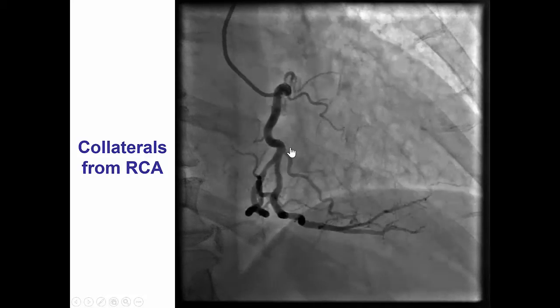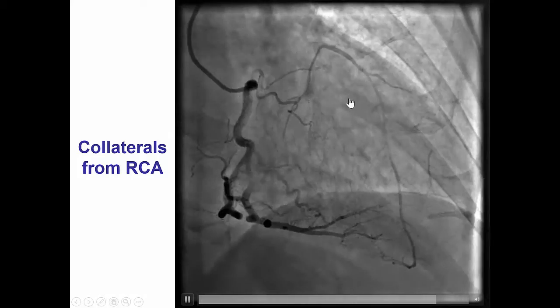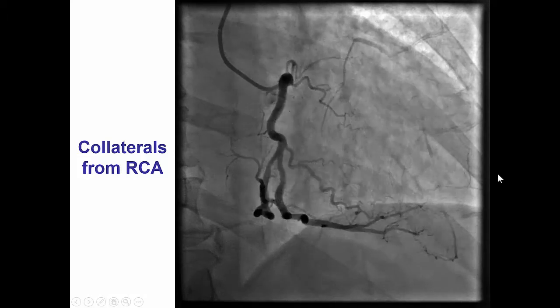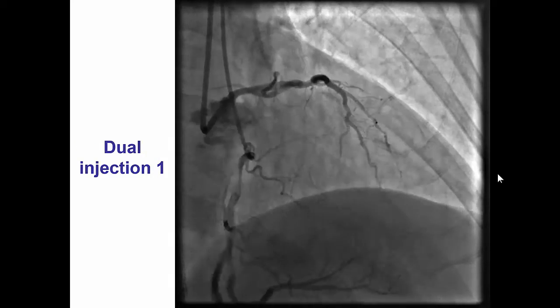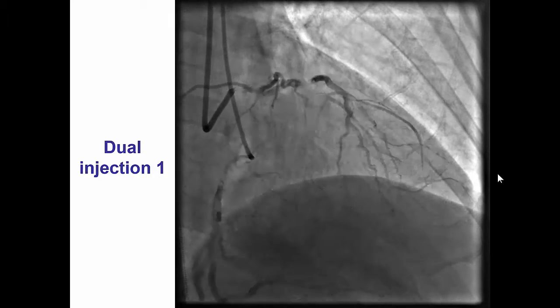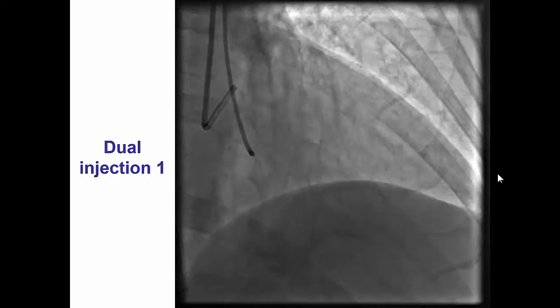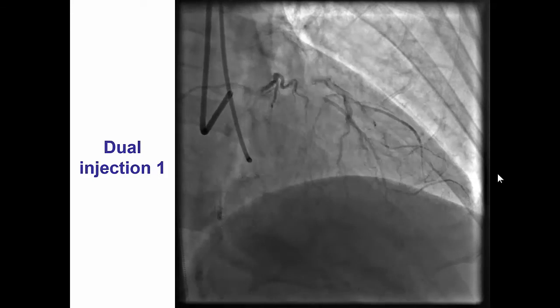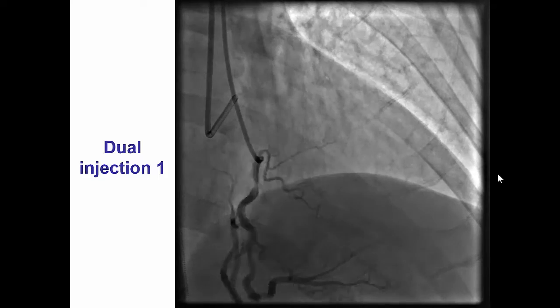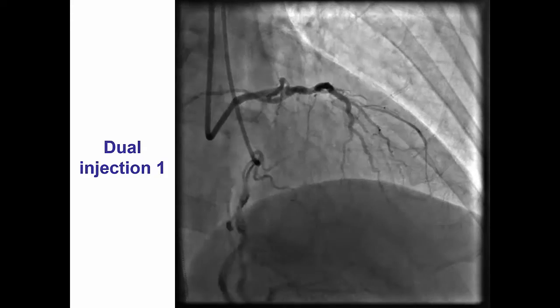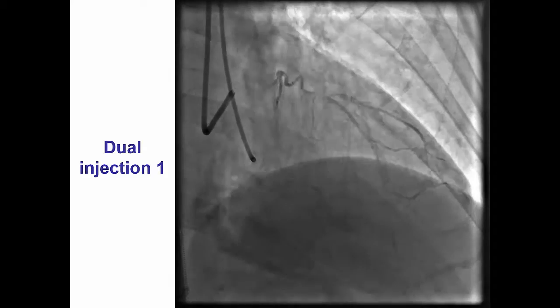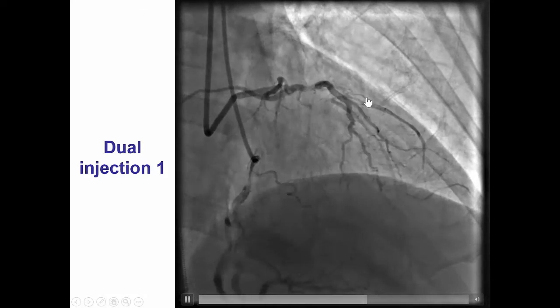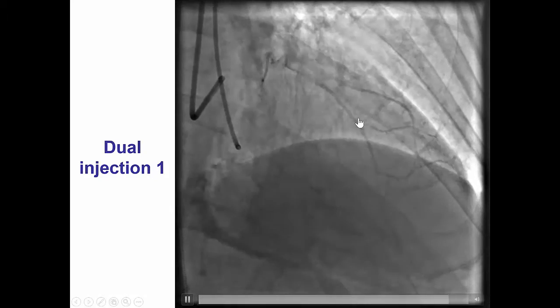The LAD was filling retrograde by collaterals from the right coronary artery. There were several septal collaterals supplying the vessel. The patient was referred for an attempt of CTO PCI of the left anterior descending artery given that he had single-vessel disease. Dual injection was performed. We can now see better that the LAD is a large-caliber vessel. There is a bifurcation at the distal cap — a bifurcation of the diagonal and the LAD.